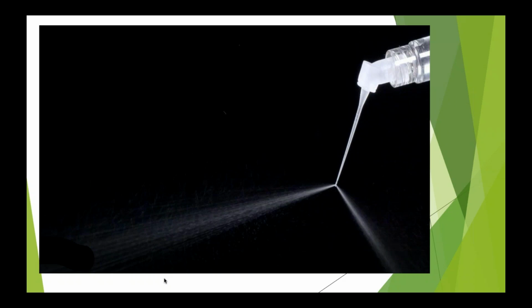Now, this is called an Irriflex. This Irriflex is out of Switzerland and it's being marketed by Dentsply Tulsa now. It's part of their George Bruder's new, well, it's not a new file system, but it's the one that they're marketing now. And unfortunately, it's escaped the name of me. But this is actually what I have started using because it's got a side ported tip in 2 different directions.